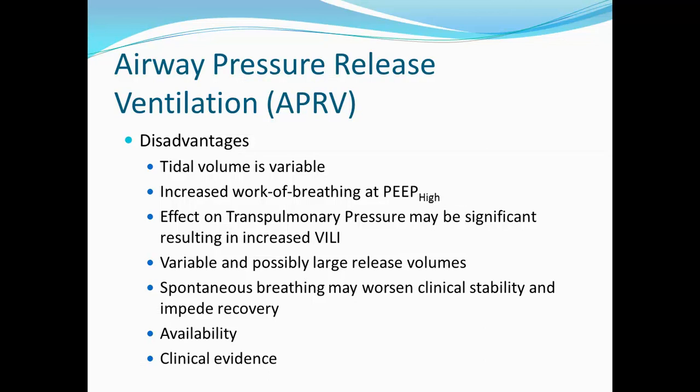One of the most significant issues I think that we need to be careful of is the lack of availability of clinical evidence. We have some evidence to show that it is beneficial, as we said previously, in improving oxygenation, in improving hemodynamic function, but we have very little evidence showing that it reduces mortality.